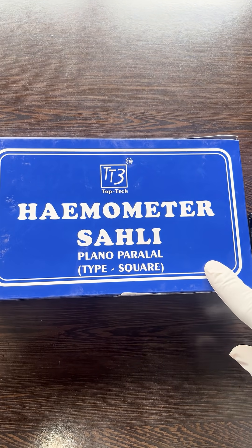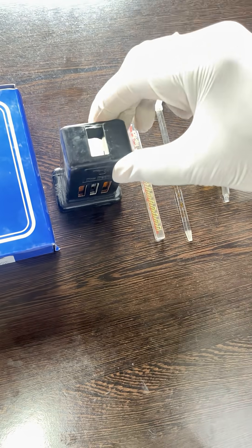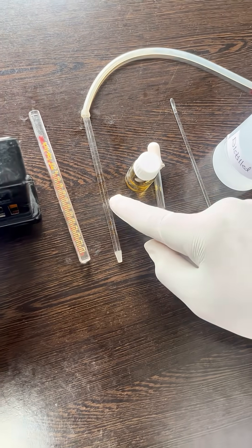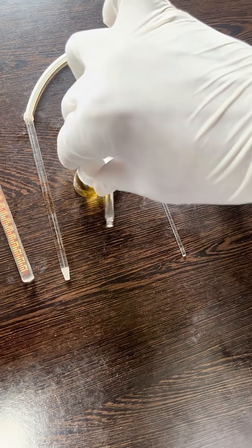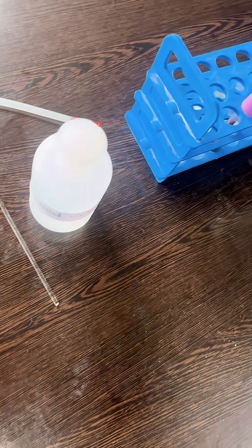We need a Sahli's haemoglobinometer. It consists of a standard brown glass comparator, a haemoglobin graduated tube, a haemoglobin pipette, N/10 HCl, distilled water, a glass stirrer, and a blood sample.